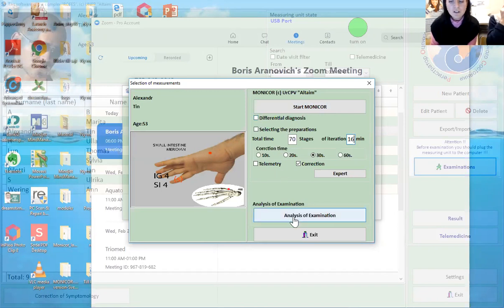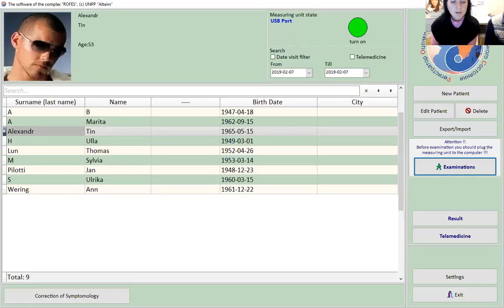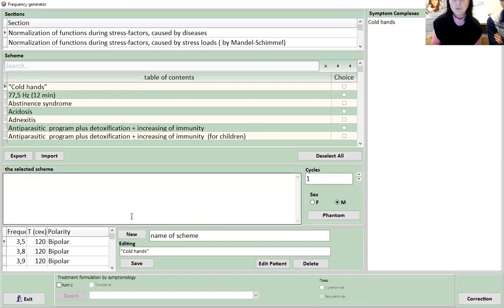For example, I have one client that cannot be treated. He has a pacemaker. We can measure him, but it's better not to. This is microamperes. It is electricity in some way, and people with pacemakers can really react to this. So I sent him the strips by mail. I did his measurement once, and then I just go to his name and press correction, and I'm doing his heart and different things, and he also wants to correct the prostate. So he feels good from these strips, and he doesn't have to come. He cannot even be treated with Monicor, only with these strips.